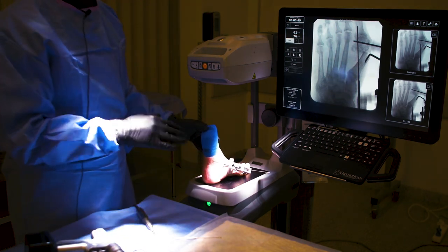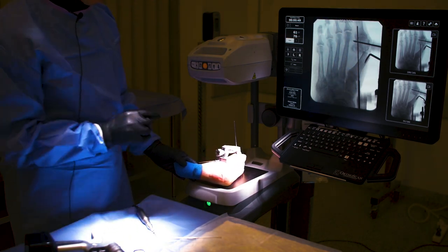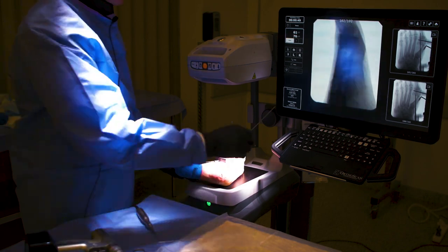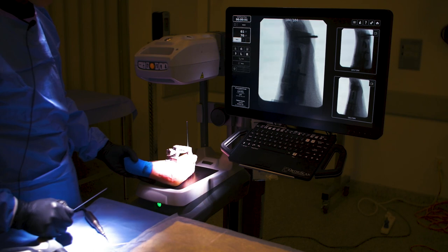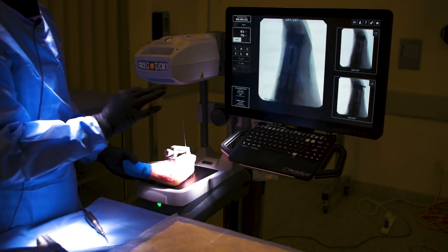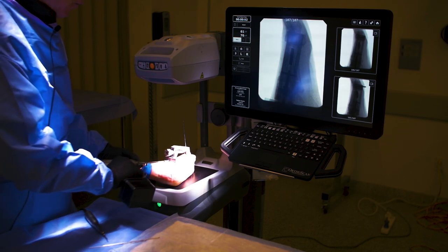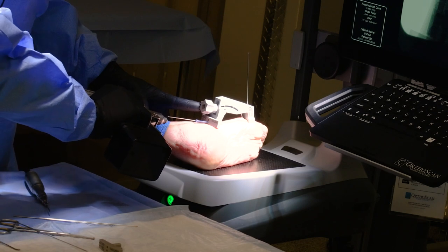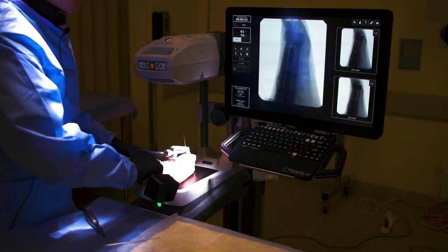Even though I've drawn out my anatomy and I think my guide is sitting parallel and in line with my first metatarsal shaft and head, I need to get an image to confirm. The image is correct because that's your hook reference: if you tilt it, the hook is off; but smack down the center — there I am. The guide is radiolucent so I can see through it. Here's my head, here's my shaft, it's in line — the head is not going too dorsal or too plantar, something we had to worry about when doing this manually. Now I'll start advancing this wire, checking that it's aiming toward the center of the head, and there it goes down the shaft nicely.